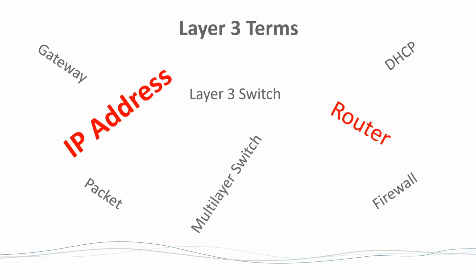Firewall. I think everybody kind of knows what a firewall is, but firewall essentially is what's going to block certain traffic from coming through. And it does that based on a lot of things. The simplest ones do it based on the IP, source and destination IP address, and the port. We haven't talked about ports. Ports is the next layer up.